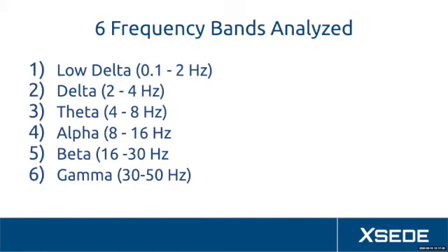So Mona took the raw data, which she'll explain a little bit about, and then she converted to low delta. She did a frequency band analysis, and we looked at low delta, delta, theta, alpha, beta, and gamma, and you can see the frequency of each on the right. Those were suggested by Eric Hallgren, our chief brain in sleep and MEG. Next slide, please.